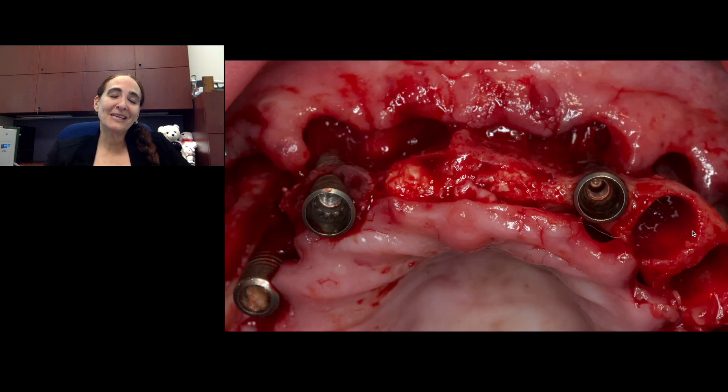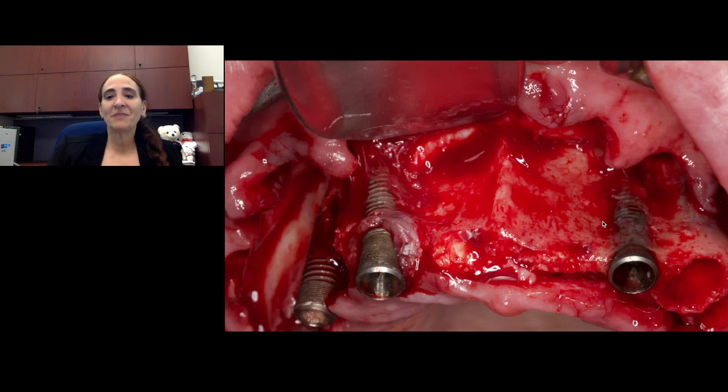Looking at this case, you can probably say you don't need ISQ measurements to tell you that these implants are not in good shape — and that's correct. We didn't even measure these because we could see that the amount of bone loss was pretty significant. So these implants were removed.